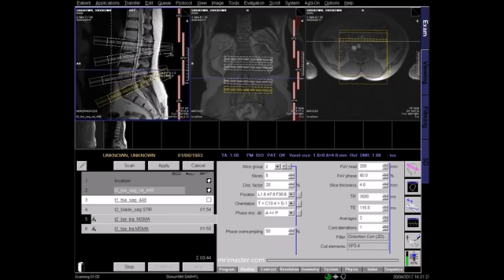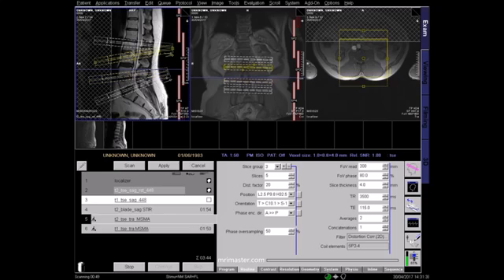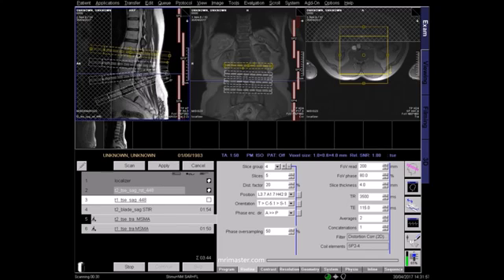Cover the last 4 intervertebral discs and any others that appear abnormal or prolapsed. You should also cover any other pathology that's seen in the vertebra or spinal canal by adding slices. Scroll through the image to ensure slices are sufficient to cover each intervertebral disc from top to bottom. A group of 5 slices is usually sufficient.